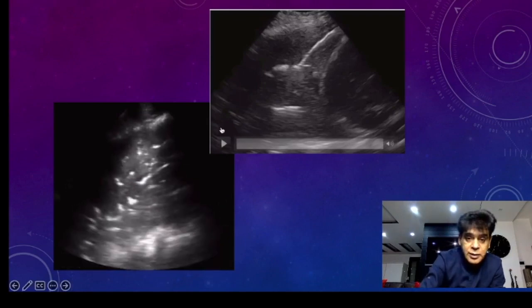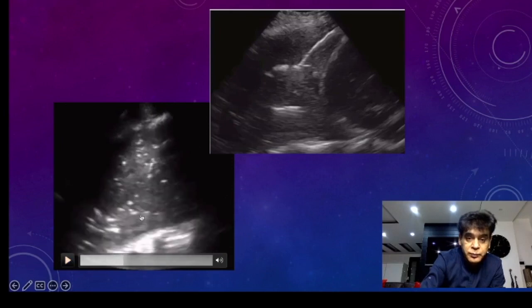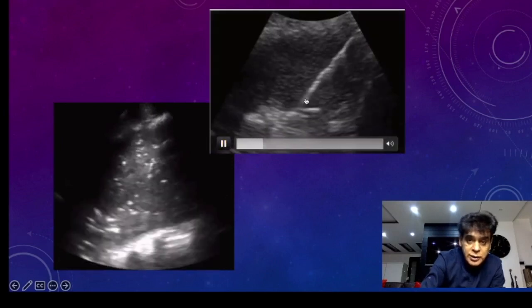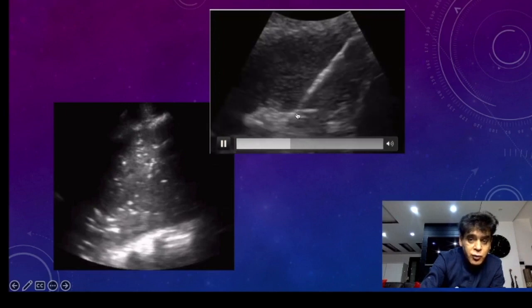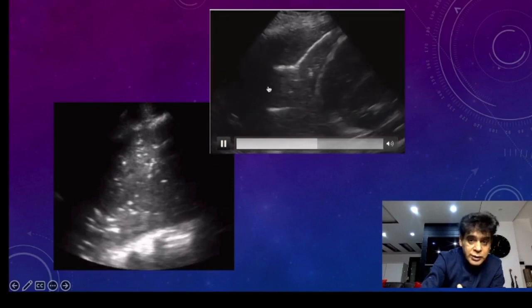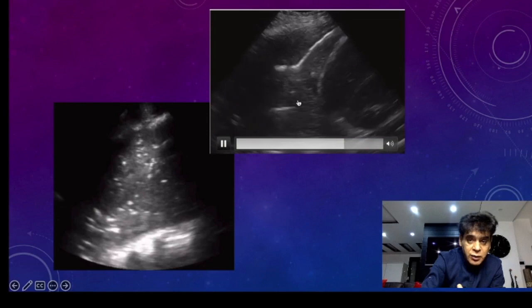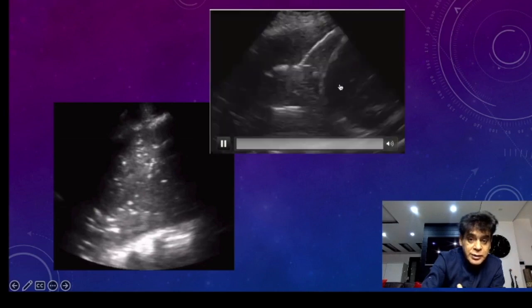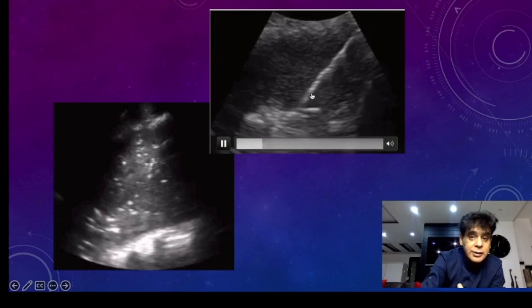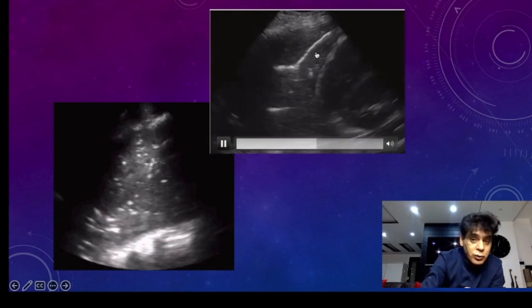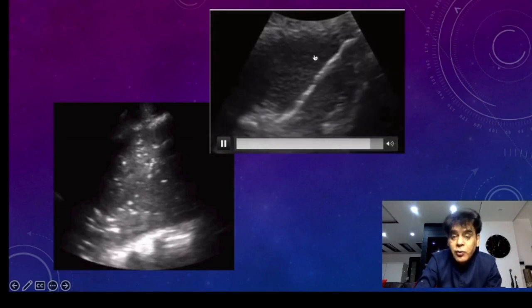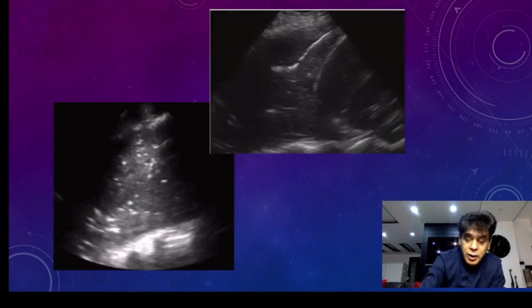Let us see another picture. Again, you can see these air particles moving up and down. You can see the hepatized area of the lung. This hepatized area suggests that this is a case of consolidation and not collapse, because not only are we seeing the air bronchogram, but we are seeing the air bronchogram moving up and down.